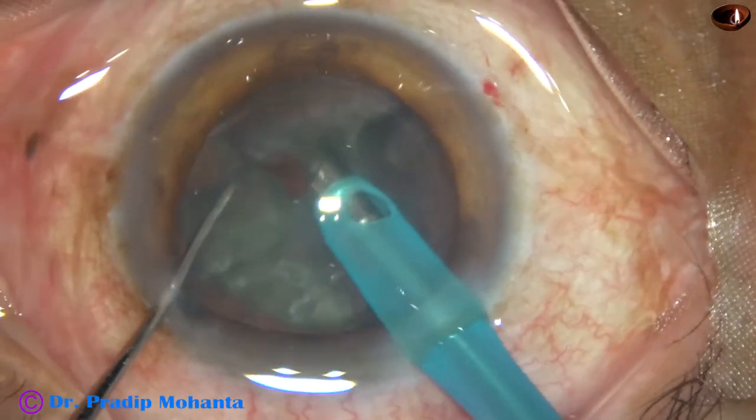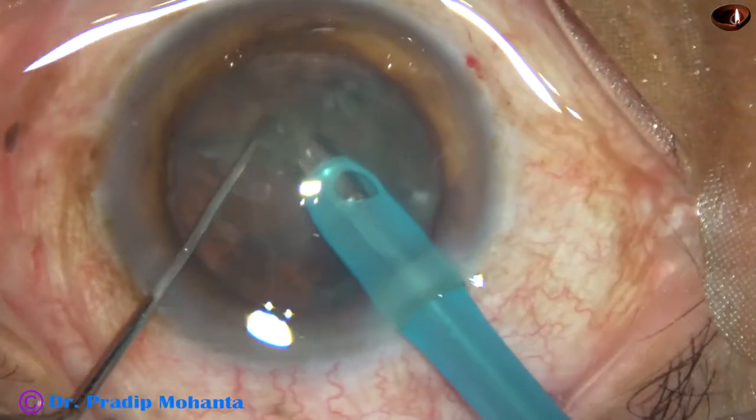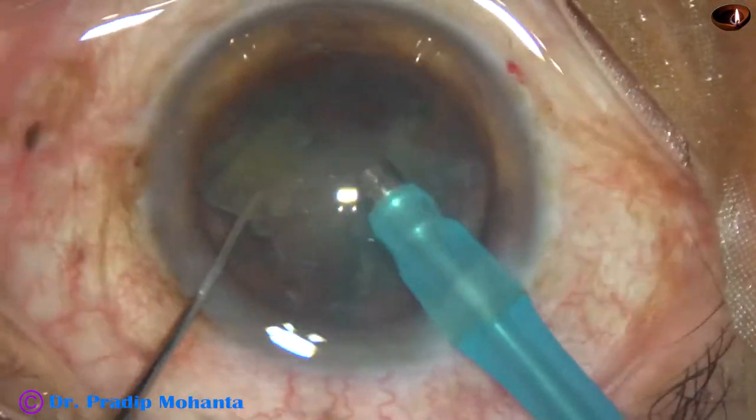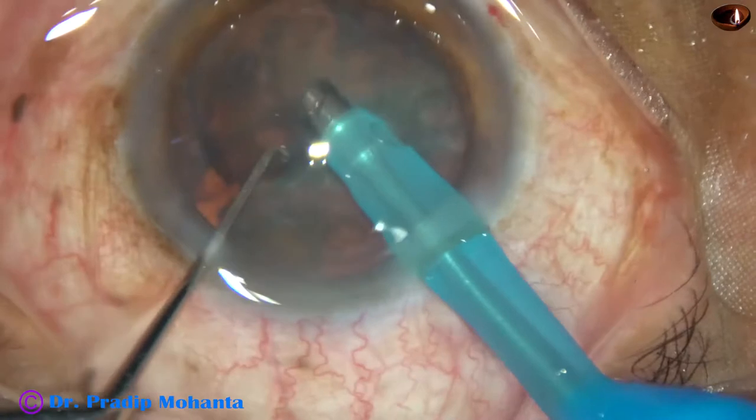This is a very useful technique in soft cataracts where we cannot hold the nuclear mass. If we try to hold it, we just eat off the matter in front.